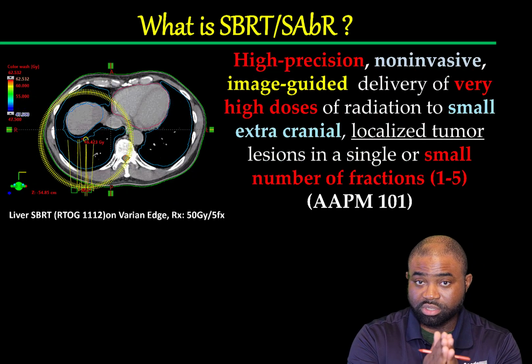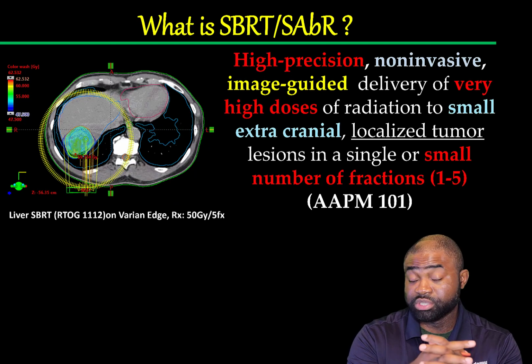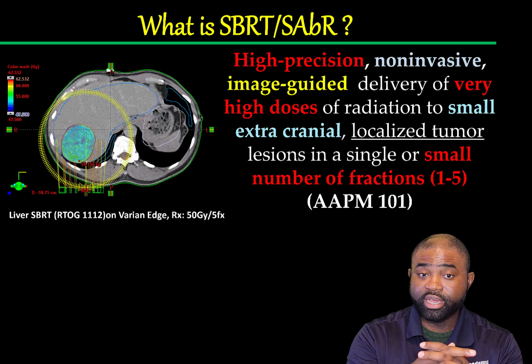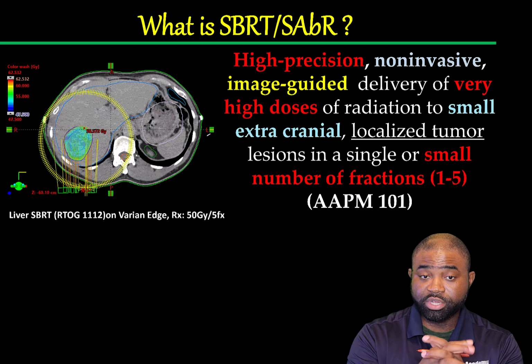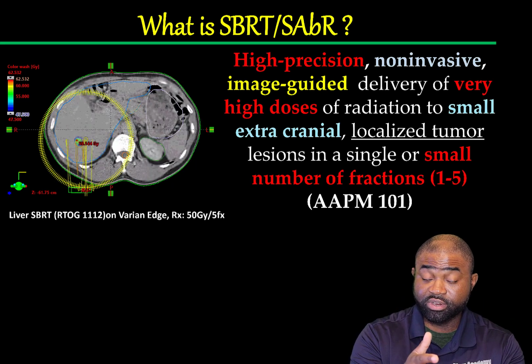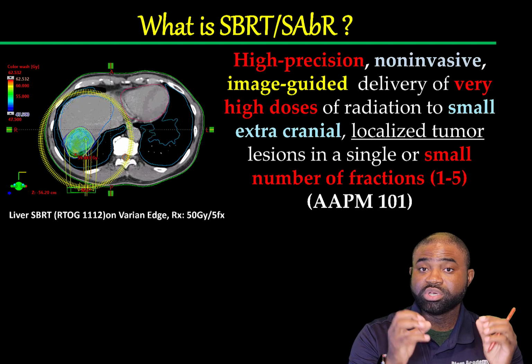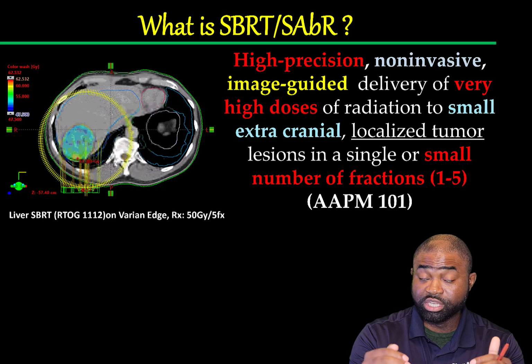The next question on the list is, what is stereotactic body radiation therapy? Some people prefer to call it stereotactic ablative radiation therapy. Now, SBRT, as we shall call it henceforth, typically is a very high precision, just like SRS, non-invasive, image-guided delivery of very high doses of radiation to small extracranial lesions.